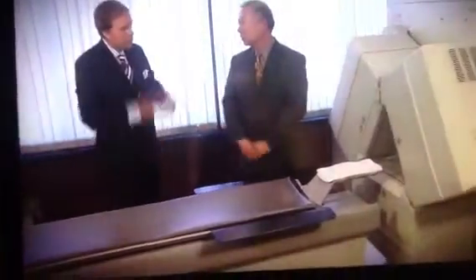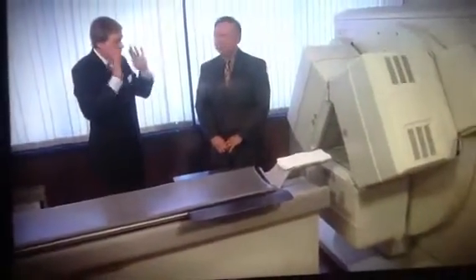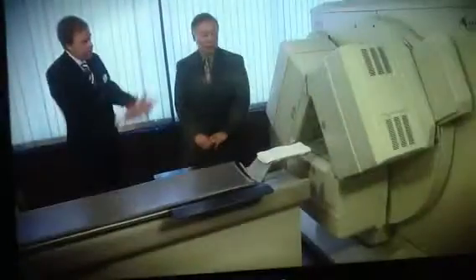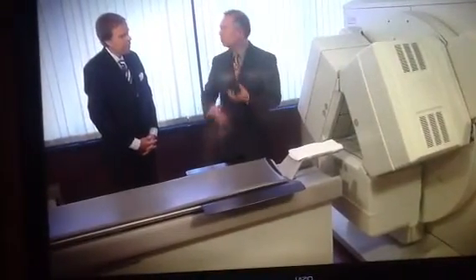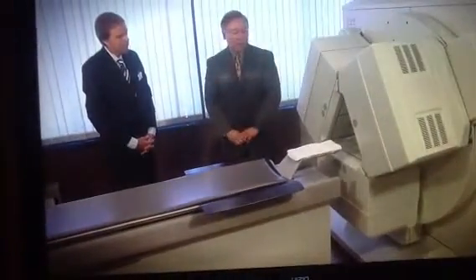So a patient goes in here, and this will slide inside this little triangle. They just lie down, close their eyes, and relax, and some people fall asleep. Do you give them any headphones with music or anything like that? No, some people want that, but generally it's just lying still, the room's dark and quiet, and they fall asleep. And they're in there for how long? About 15 minutes. Okay. Yeah, about 15 minutes, and the scan is done, and 24 hours later we'll do the second part, depending on which way we go. And that's pretty much it.